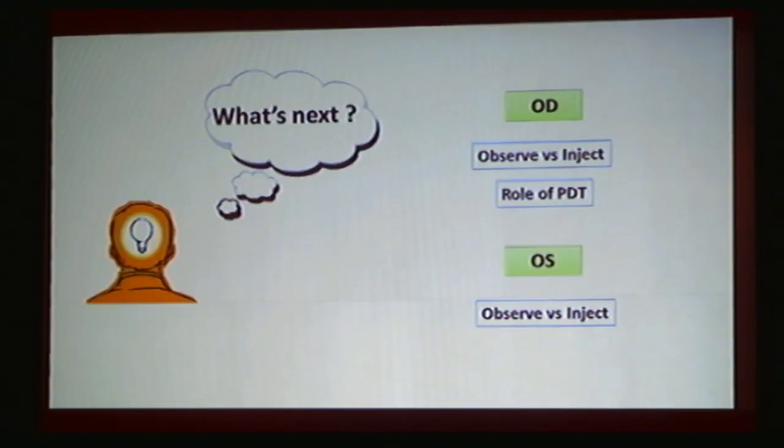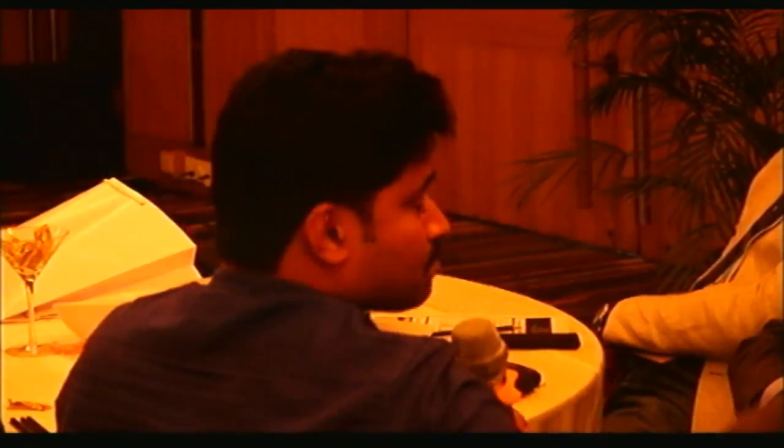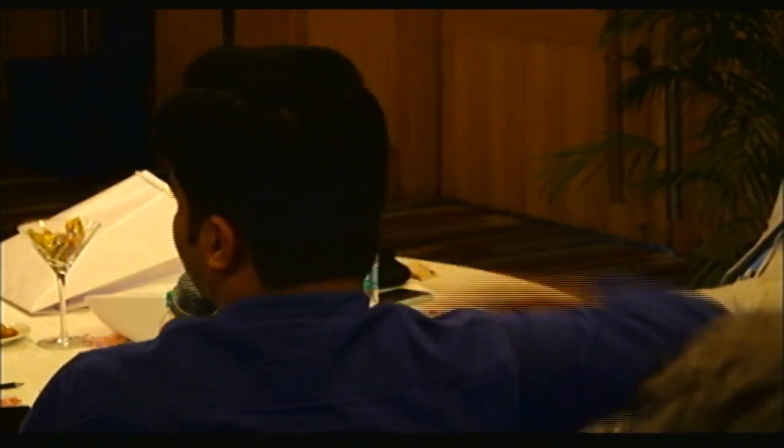The patient's right eye as of now is asymptomatic, but because of the PED he has taken 5 injections so far, with no change. The only concern the patient has is, will my right eye become like my left eye? The PED has been treated so far with the biosimilar ranibizumab. So the concern is about the right eye now. He's asymptomatic, but show that OCT of the right eye.